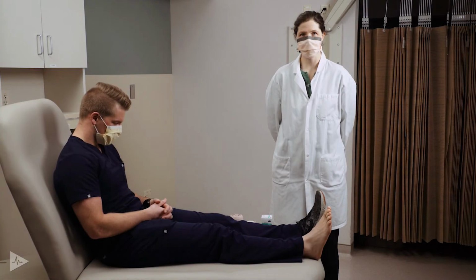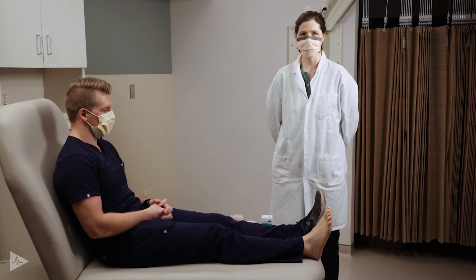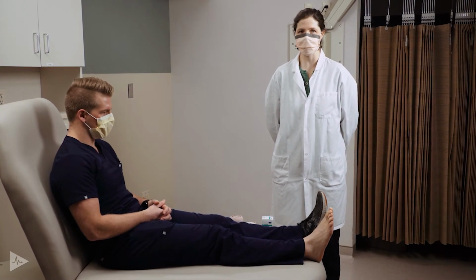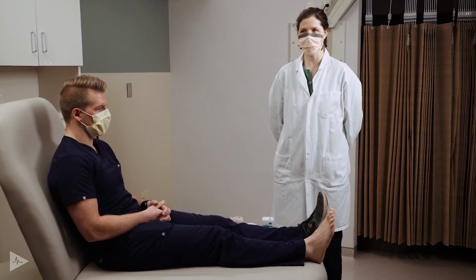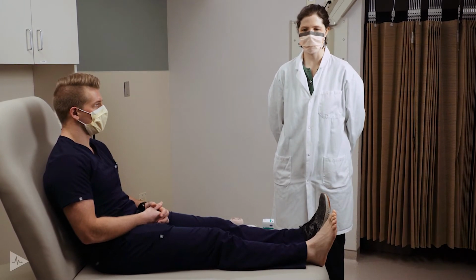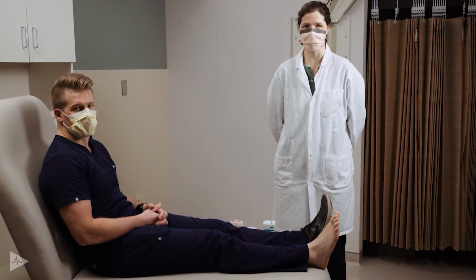So for the next portion of this presentation, we'll focus on lower extremity compression. So this is circumferential extrinsic support to help reduce lower extremity edema. Compression overall helps to manage venous disease, lymphedema, lipedema, and edema related to other comorbidities such as heart failure.